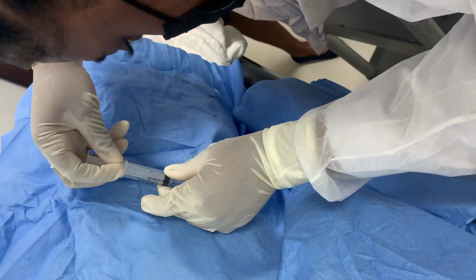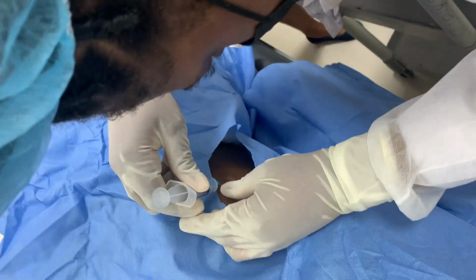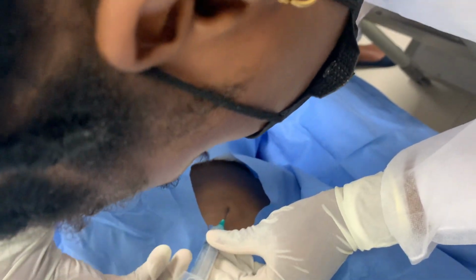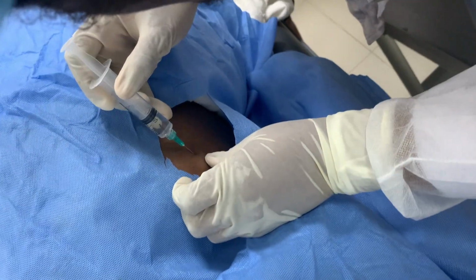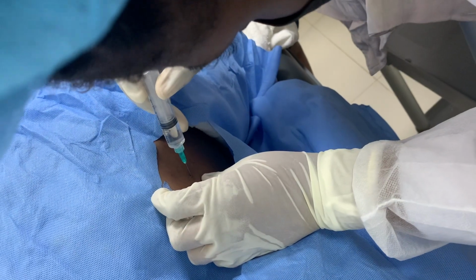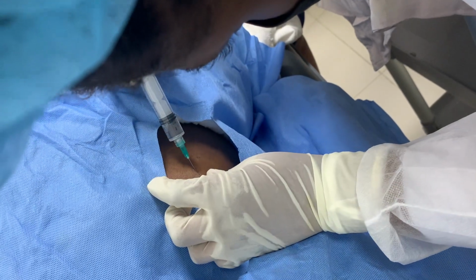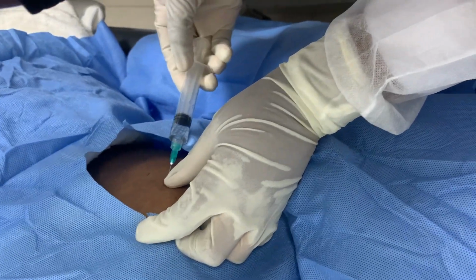So we're basically tapping this patient's abdomen with a needle, and then there's an IV line or catheter attached. You locate your McBurney's point, which is two-thirds of the way from the umbilicus to the ASIS. You locate that, and then that is where you tap for the fluid.